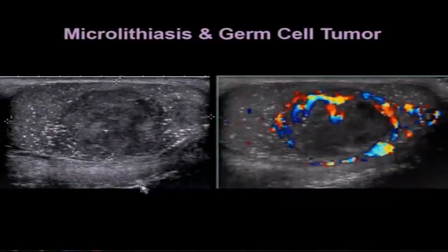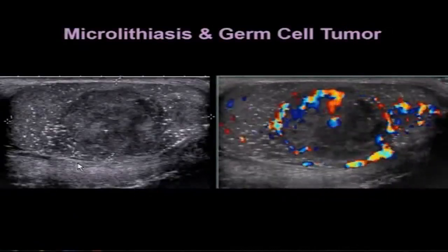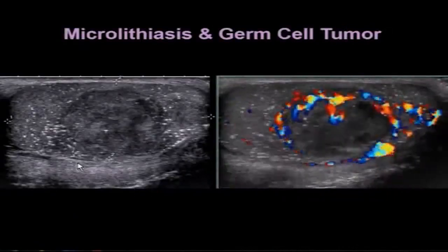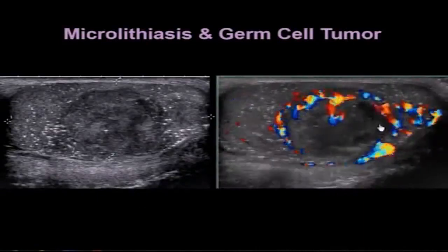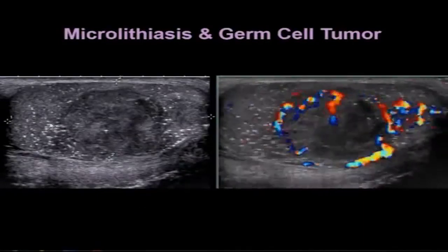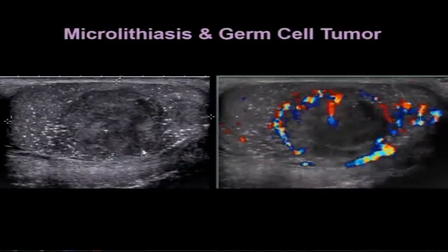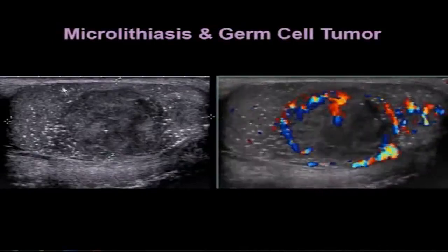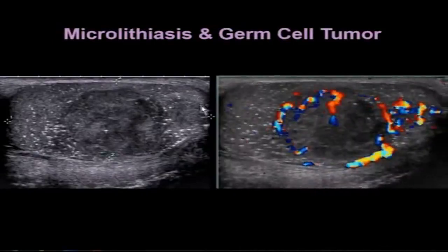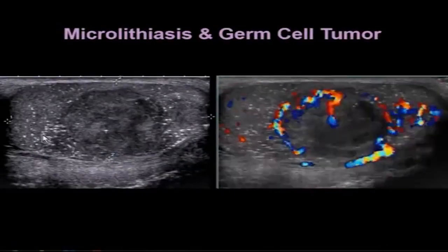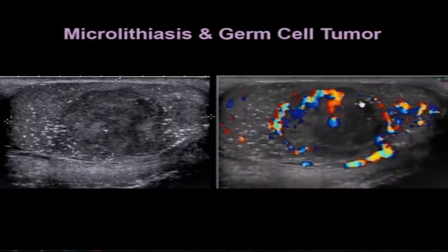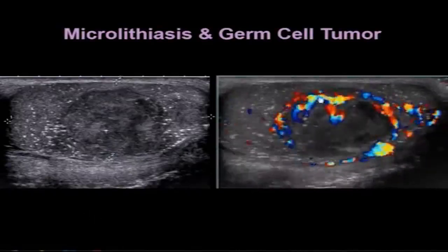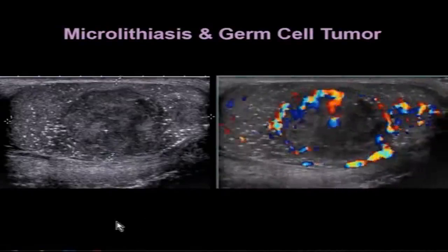This patient also has microlithiasis but developed a germ cell tumor. You can see the tumor centrally located inside the testicle — it's a hypoechoic mass. The parenchyma around the testicle has those bright microlithiasis echoes surrounding it inside the parenchyma, and notice the increased vascularity associated with the tumor.